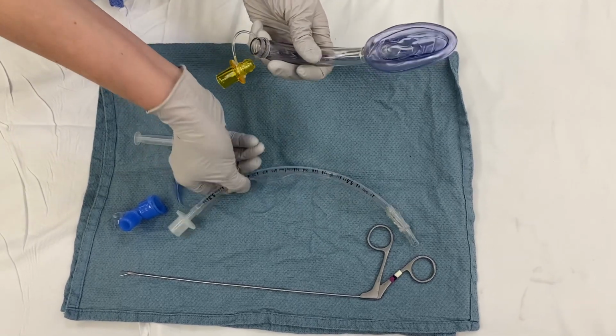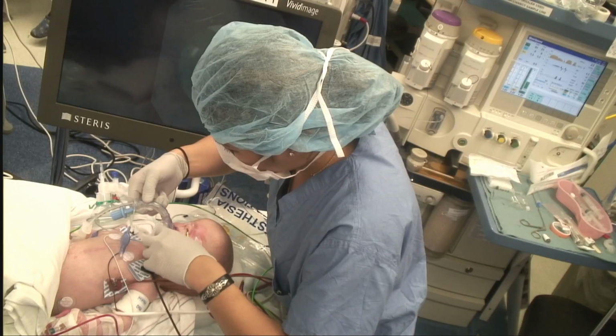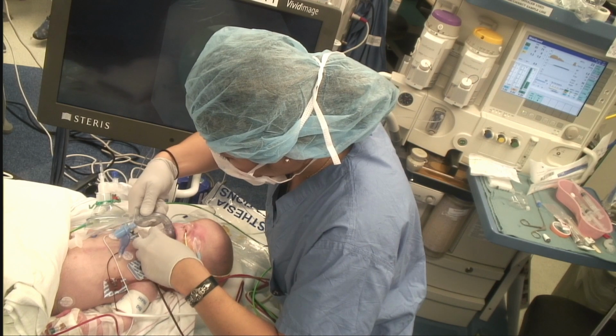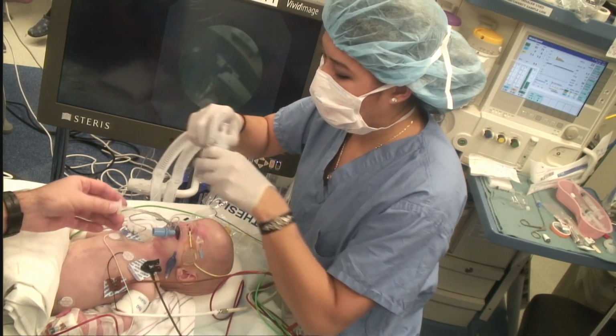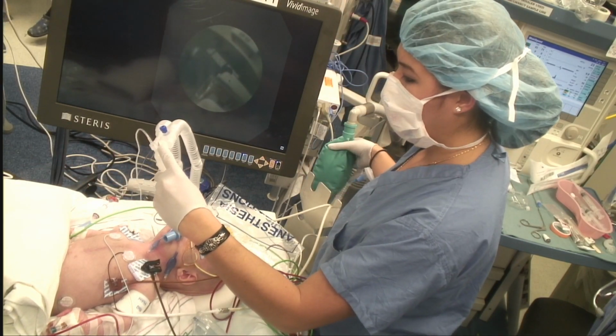The tracheal tube can be preloaded into the supraglottic device and placed as a single unit into a patient where this intubation technique is pre-planned, or the tube can be loaded after a supraglottic device is placed, such as during a rescue intubation. The tracheal tube should be placed from halfway to nearly the end of the conduit, allowing some of the conduit to be visible at the fiberscopic exits. As the fiberscope exits the tracheal tube, it provides the user with a better perspective of the patient's anatomy, and if needed, makes it easier to adjust the supraglottic airway device to better align with the larynx.